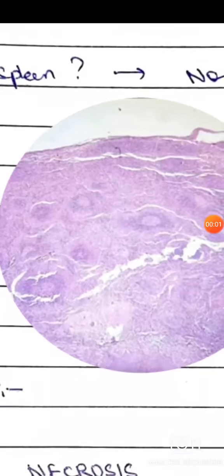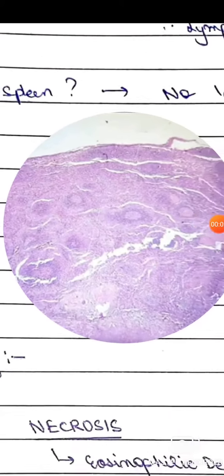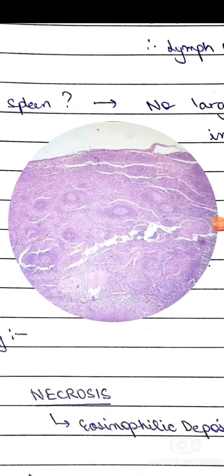Hello everyone. This is our histopathological slide. First of all, we need to identify which organ it is. We have two identification marks: first is the fibrous capsule, and second is the lymphoid follicles. So it's a lymph node.